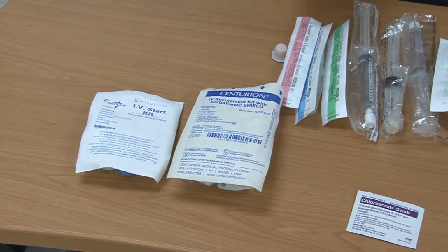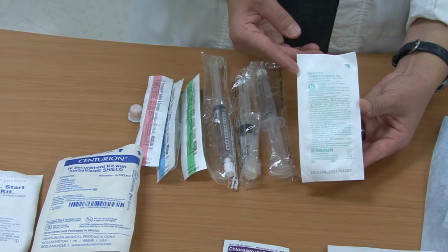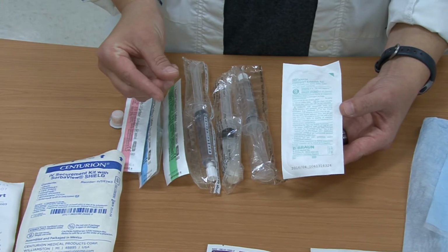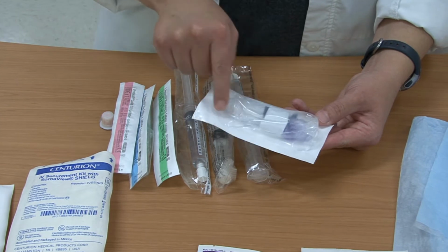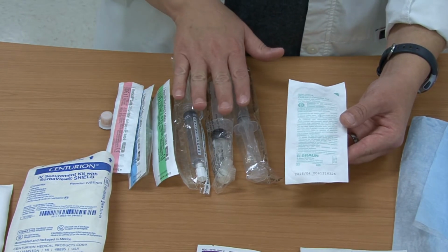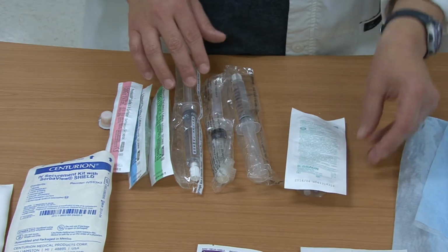Other equipment that you might need would be the IV extension set or the saline lock. And this is the piece that actually connects to the hub of the IV that is in the patient. And you'd need to prepare this first because in the package originally there's nothing but air in here. So you'd want to make sure before you actually start the IV that you have a saline lock flush and that you've attached it and flushed it. And we'll do that here in just a little bit.